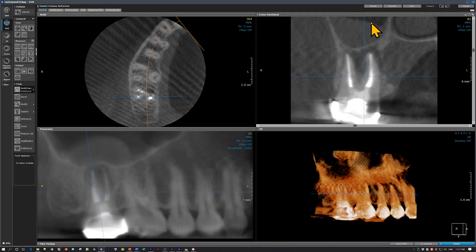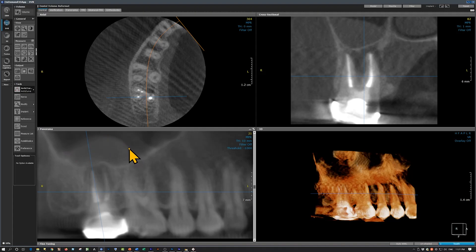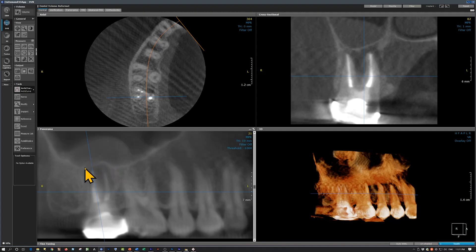We see a soft tissue density mass here, and we can see this mass better on this image. This is the mass that we had seen on the periapical radiograph, and it is consistent with a retention pseudocyst. On this view, here is the radiolucency and we can appreciate that there is slight elevation of the sinus floor.